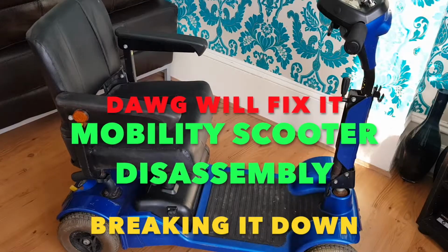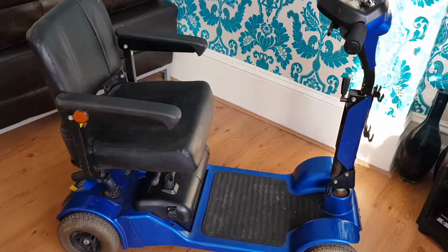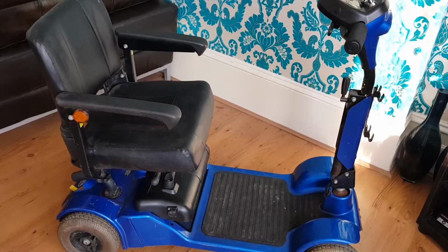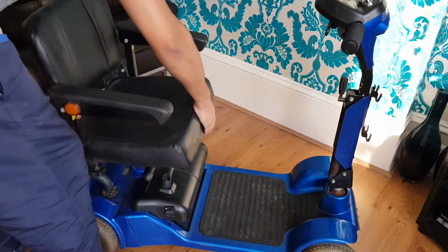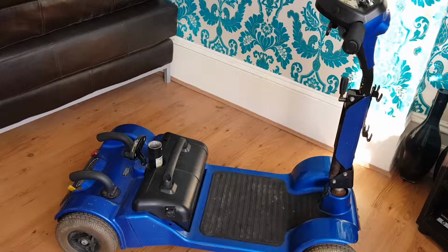I'm going to show you quickly how to take this thing apart and basically put it back together. So the first thing we do is pop the seat out. There's probably a screw holding it in, but on this one I got from the charity, there's no screw, so we just pop the seat out, done. Okay, easy, right? Then we grab the battery.